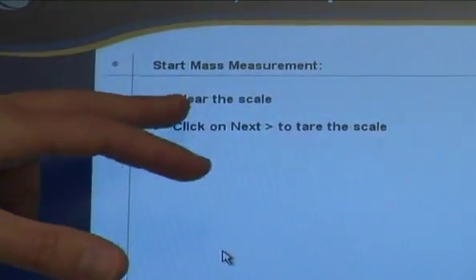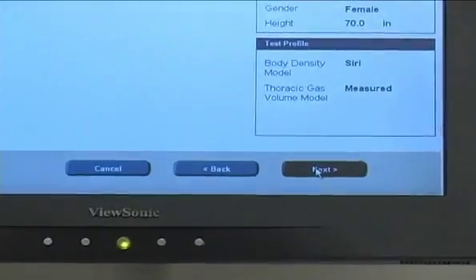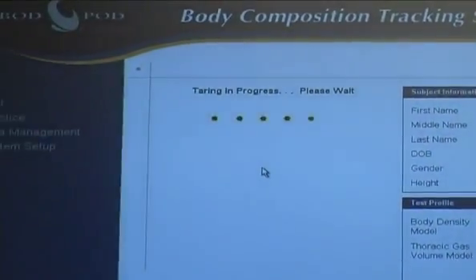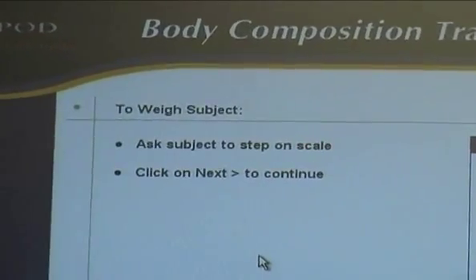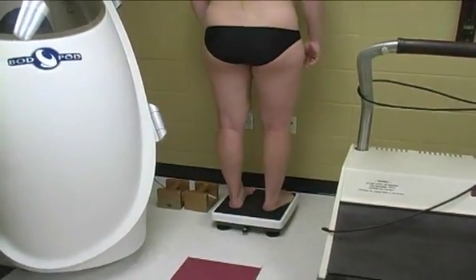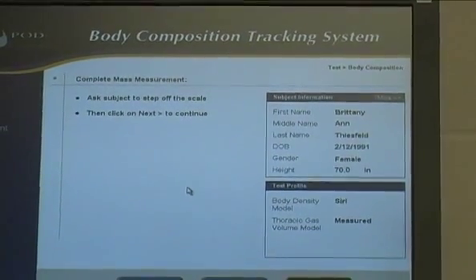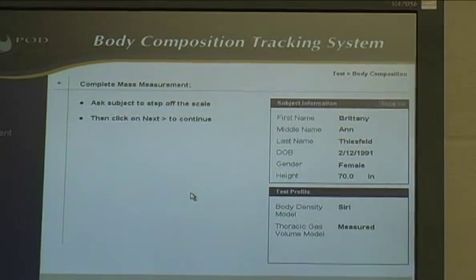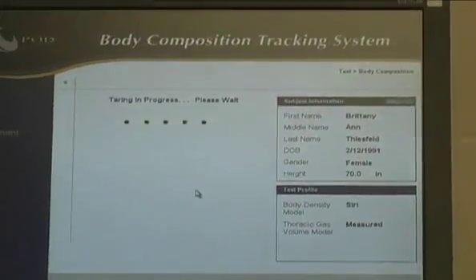So this will tare the scale. It's a clear scale, so you just want to make sure that there's nothing on the scale. Next, tare the scale. So taring is in progress. This will be a few seconds. Okay, so it says, ask subject to step on scale and then click next. So what I typically say is, Brittany, if you could get on the scale, it's about a 5-second measurement. While you're up there, hold still. If she could step on the scale for 5 seconds, and the measurement's 5 seconds, and then she steps off. Stacy will click next. It's taring again, essentially 0 now.